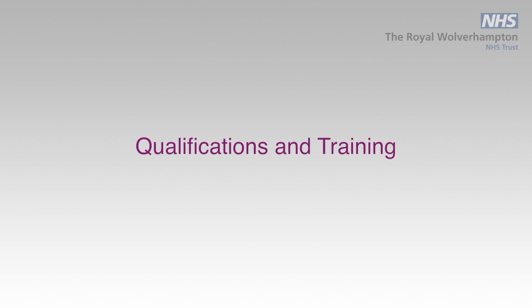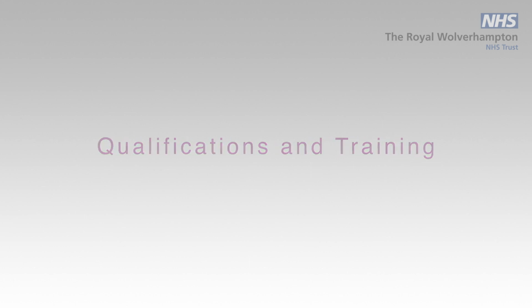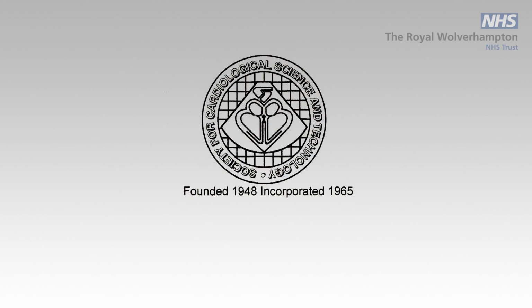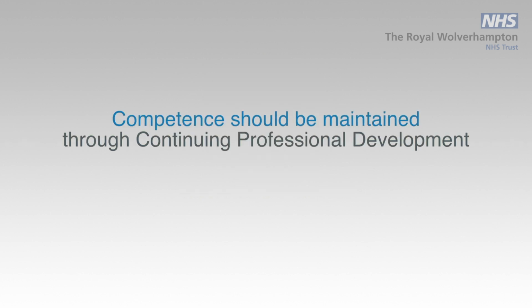The operator must be competent in the use of the ECG machine and in the recording of an ECG. Ideally, this should be demonstrated by the possession of a recognised qualification, such as those awarded by the SCST. It is essential that competence in the recording of an ECG be maintained, and this should be demonstrated by periodic review.